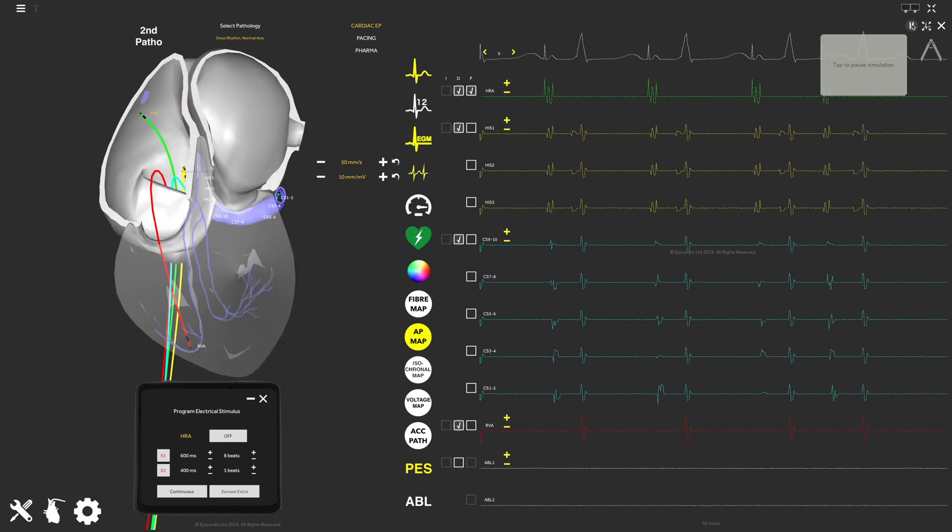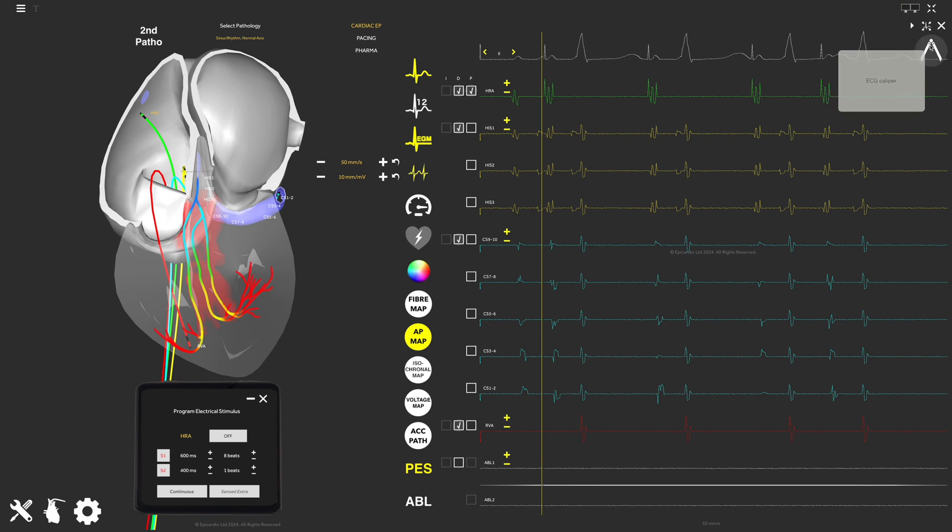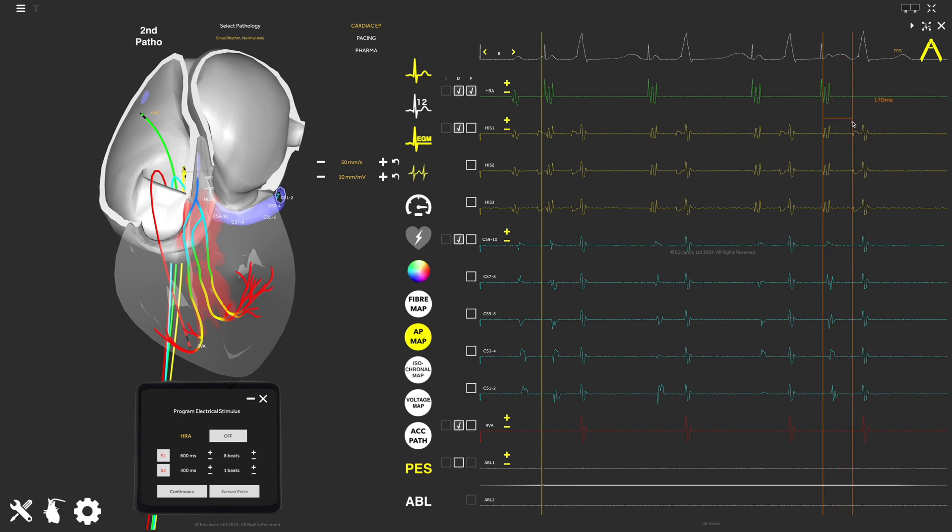Pause the simulation again and use the caliper tool to measure the A-H interval.